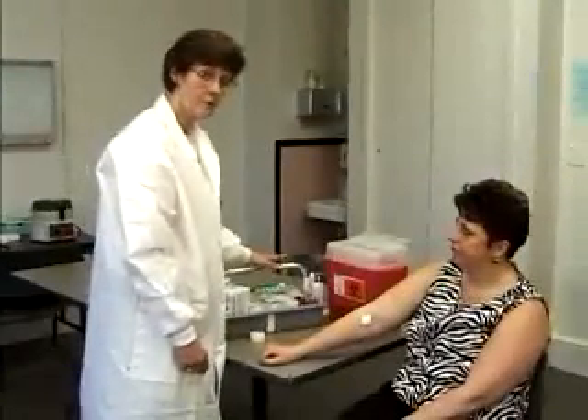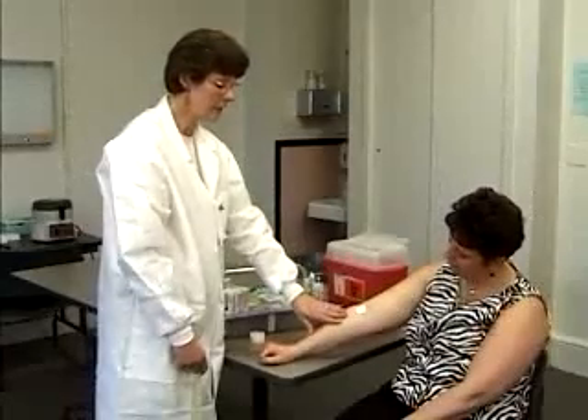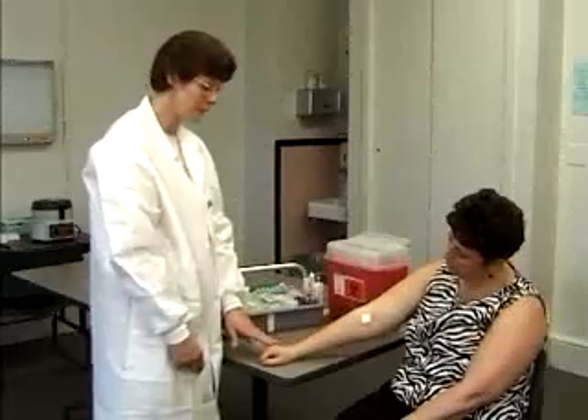If the patient's blood can't be drawn from the antecubital area, or if they have an IV and you need to go below it, the next choice would be the back of the hand.